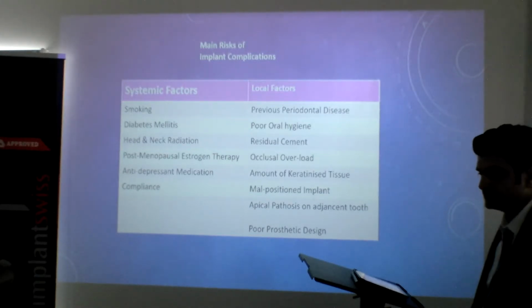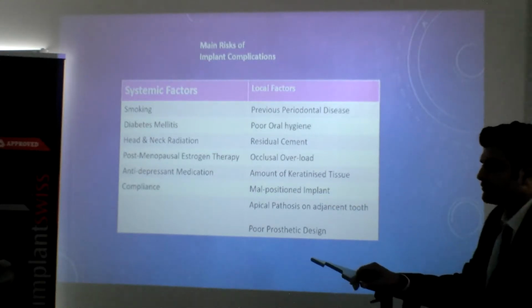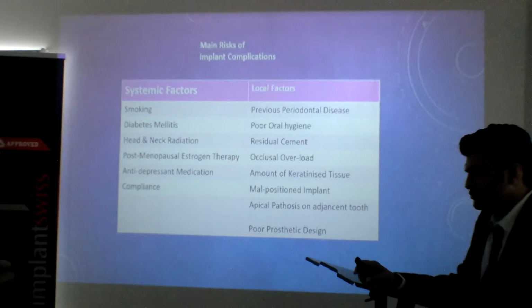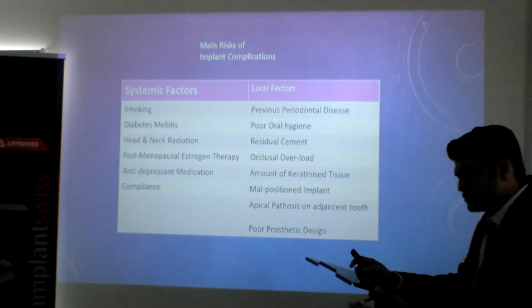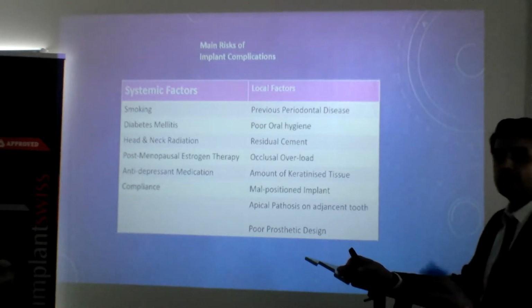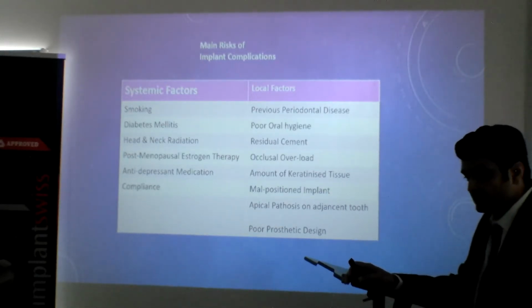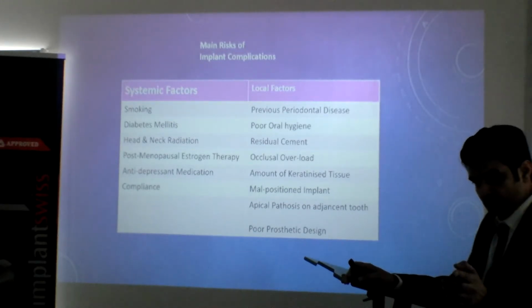If you're placing 2 implants right next to each other, it should be 4 millimeters apart, not 2 millimeters. Okay, 3 to 4. 3 millimeters. 4 is a bit much. There's a problem with 4 when it comes to papilla, the right triangles and everything. But it's case specific. Again, as clinicians, you will find things will change, right? So you would have to choose your case wisely and plan it wisely. But these are the basics, okay?